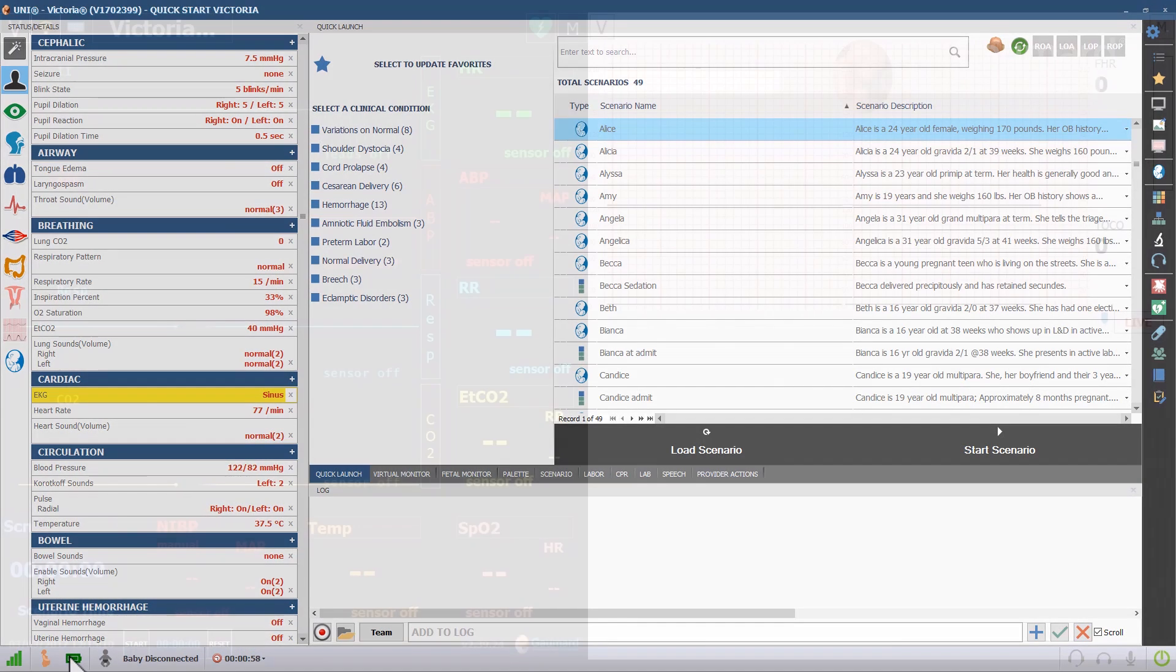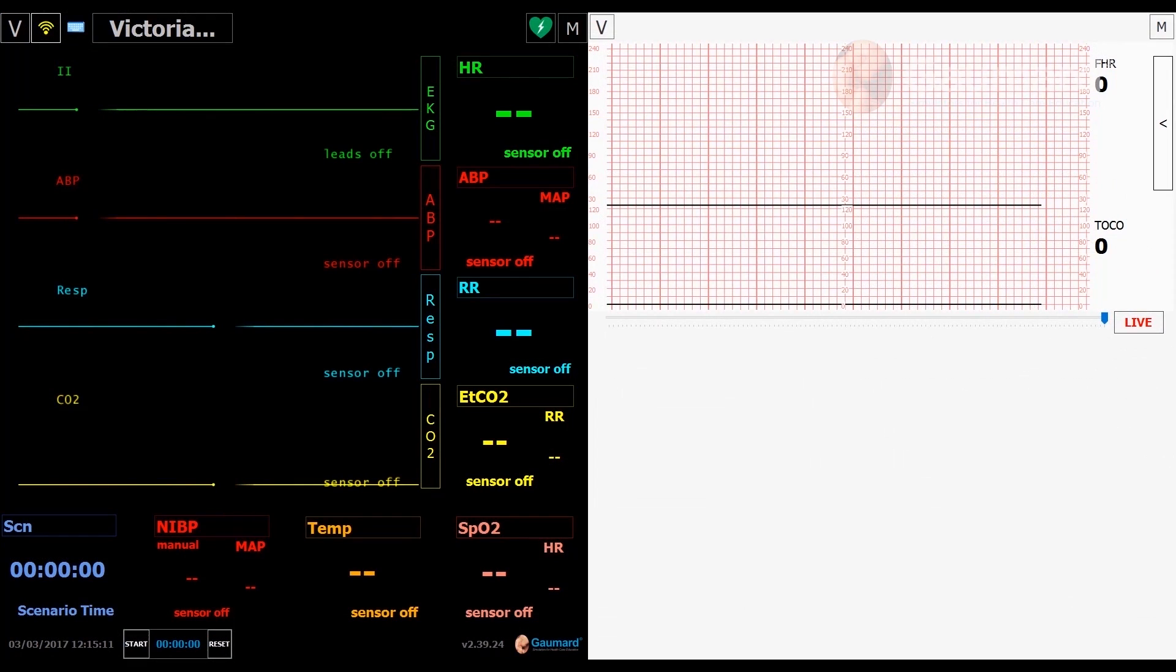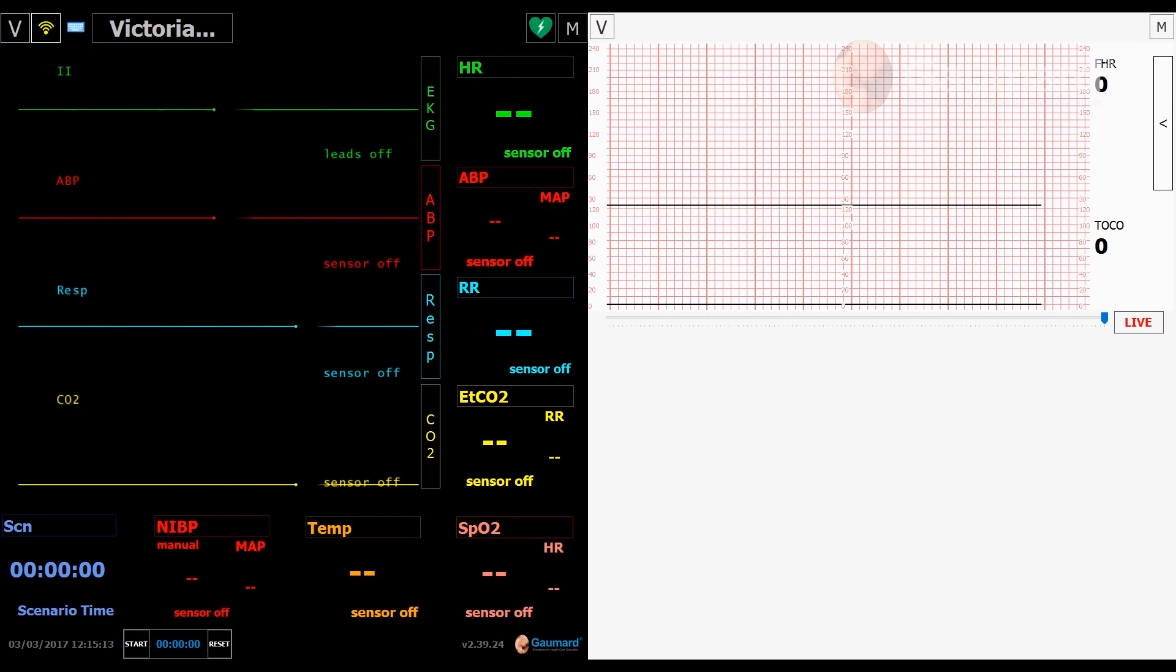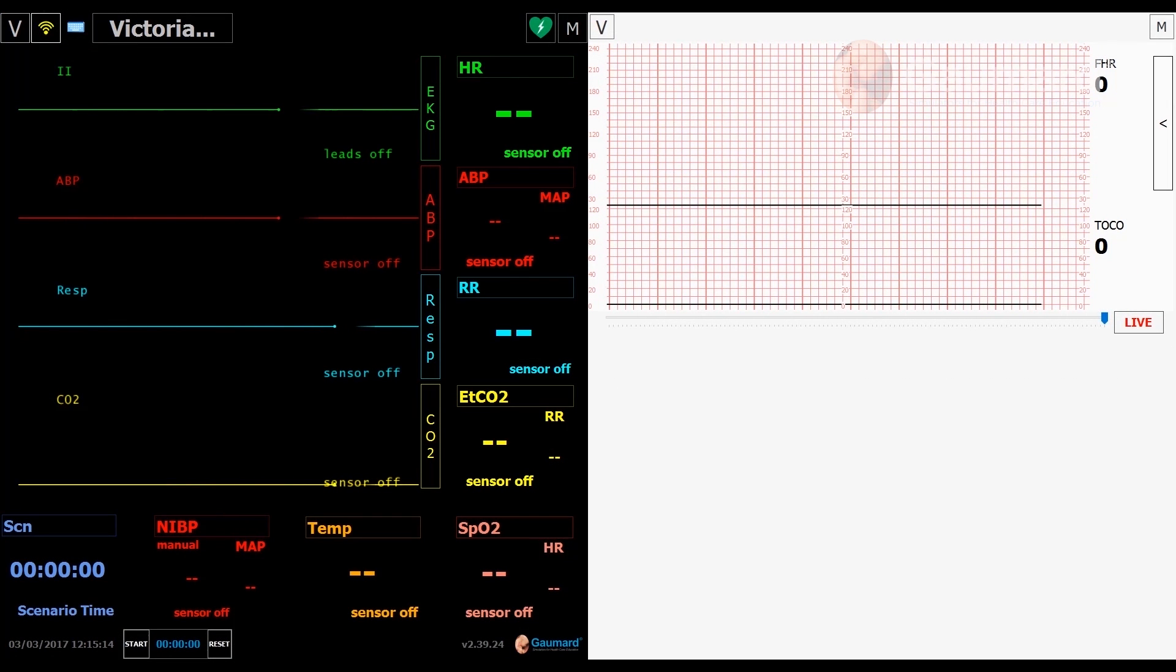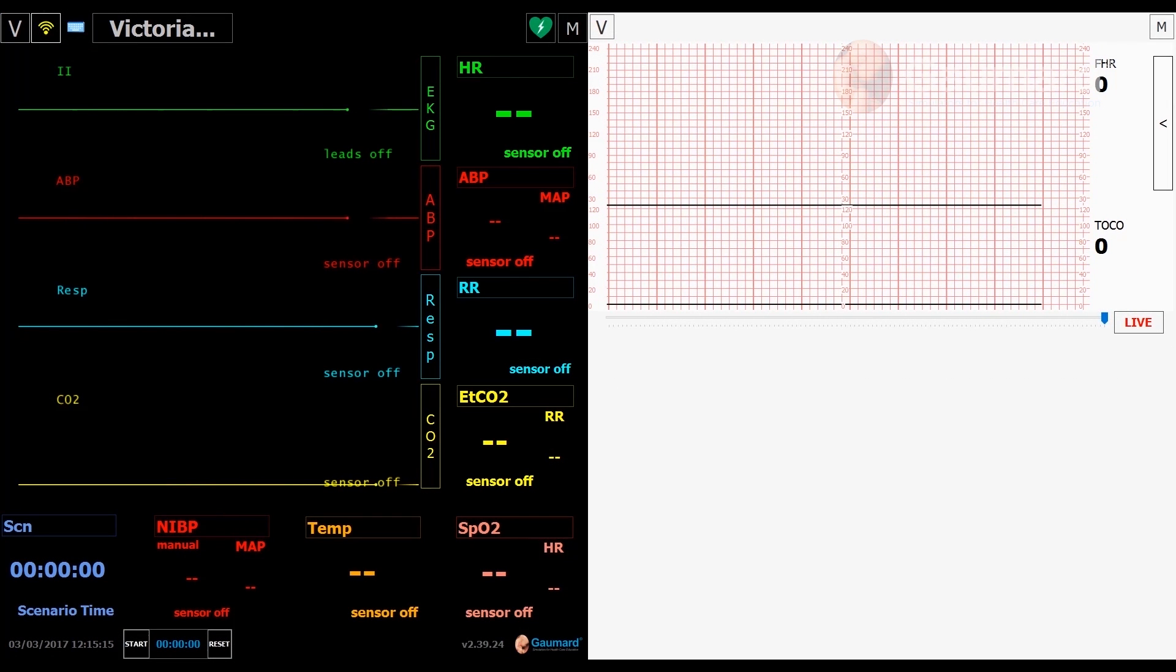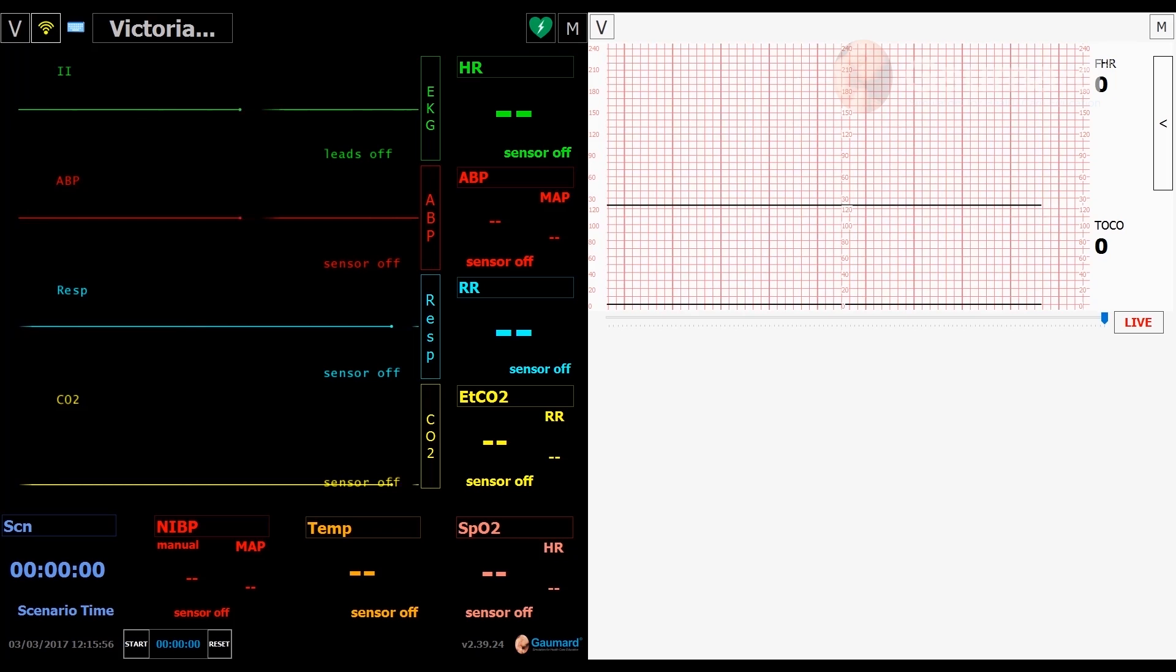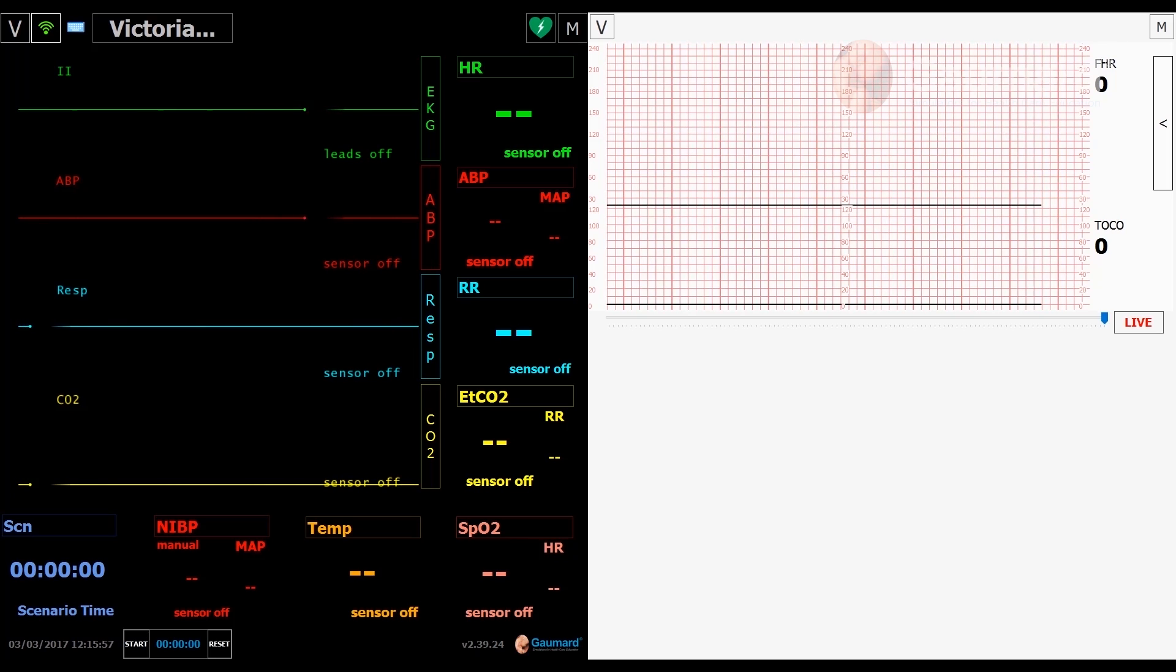When both computers are on, connecting to the same network, and running the software, the vitals on the bedside monitor will update in real time with the vitals on the tablet.